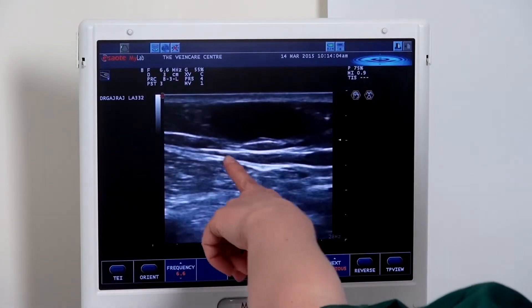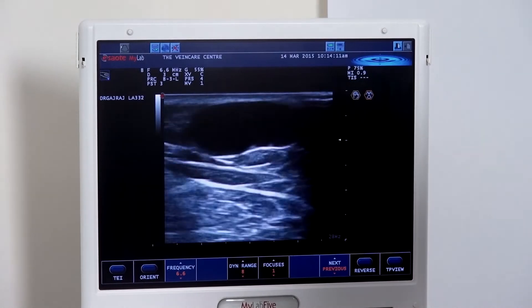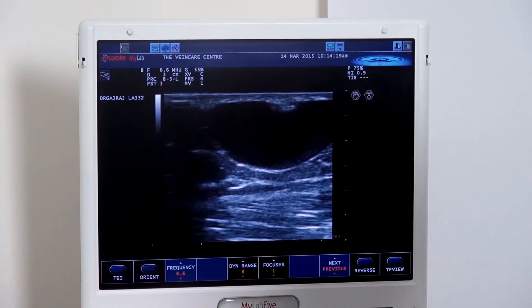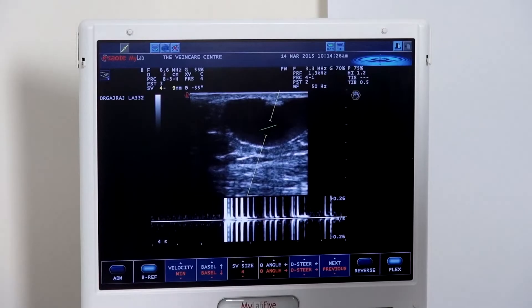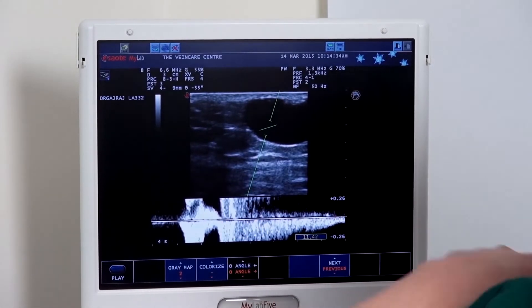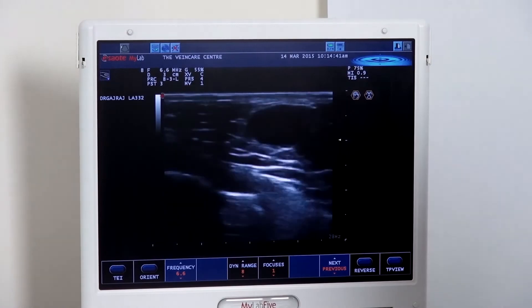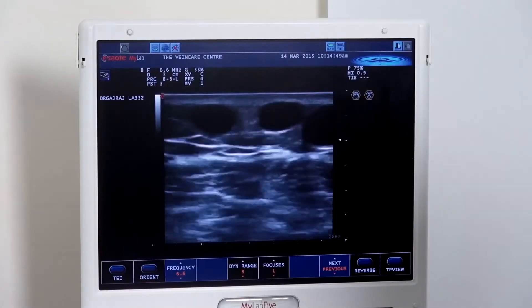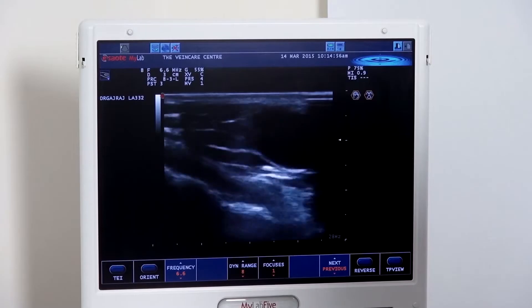We can see that this long saphenous vein actually leaves the saphenous fascia and becomes rather tortuous — we can see it wrapping around and around as we follow down. It's obviously incompetent, but we can check that again a little lower down, again demonstrating large incompetence of that long saphenous vein. You can follow this down to the level of the knee, and you can see that the visible varicose veins are all associated with the initial incompetence at the saphenofemoral junction.